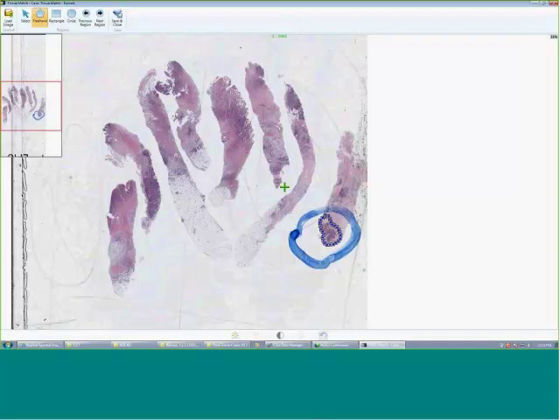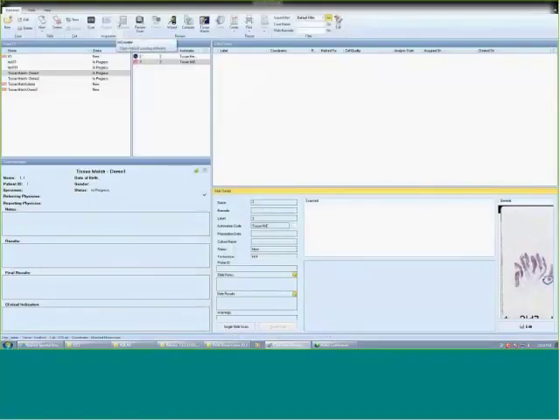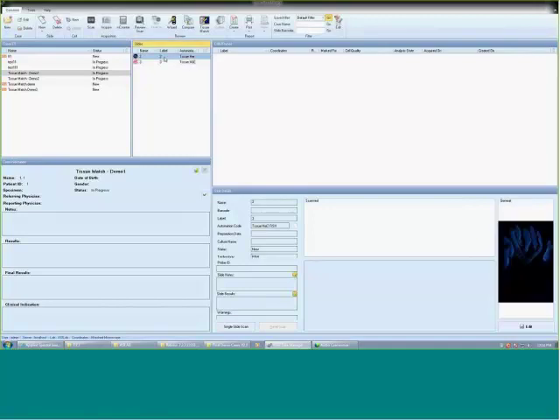And that's it. I'm done. I press Save and Close, and this information is now waiting for the fish technologist, who I will now become. The fish technologist clicks on the fish slide and clicks on the tissue match icon.